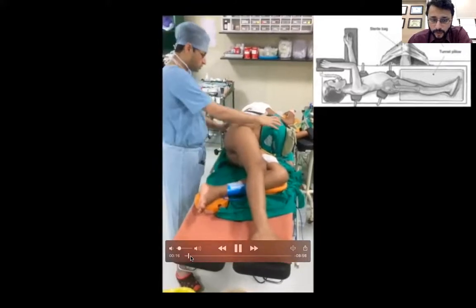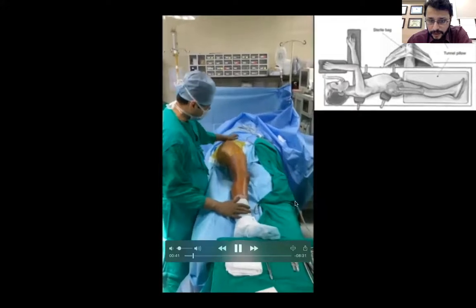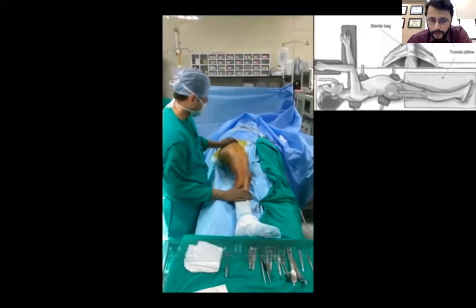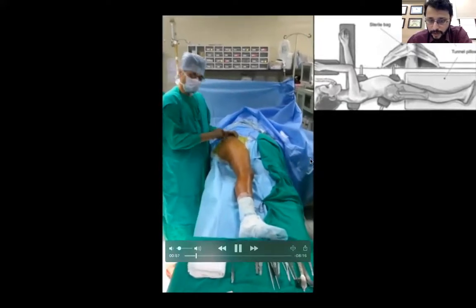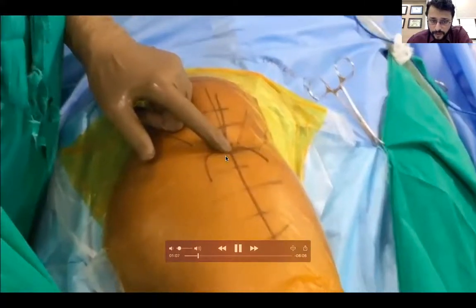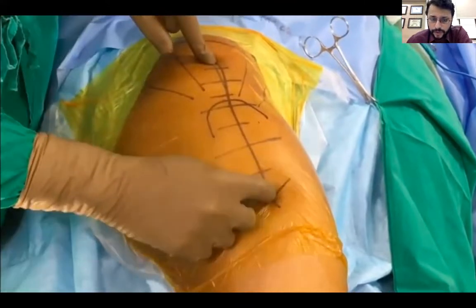I have muted the sound of the video so that I'll be able to speak extempore. Now this is the draping. One important thing is this anterior sheet. There is a pouch which we create so that the leg can fall in it when we are dislocating the head anteriorly. Right. So fully draped, just like probably a bipolar or a THR, but with this anterior bump and anterior pouch. Now it is centered on the tip of the greater trochanter, about 10 centimeters superior, 10 centimeters inferior. I take a slight anterior curve superiorly, in the direction of the tensor fasciae latae.